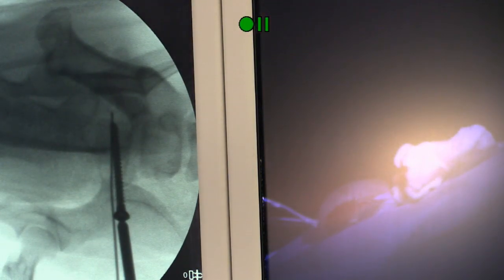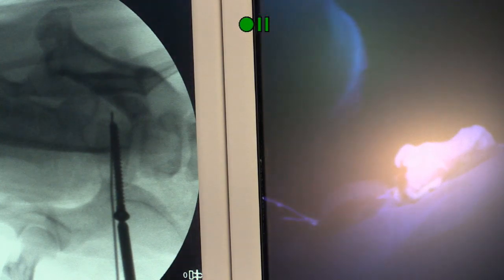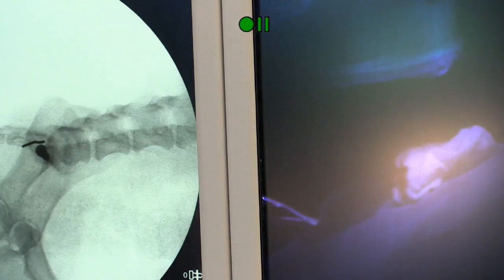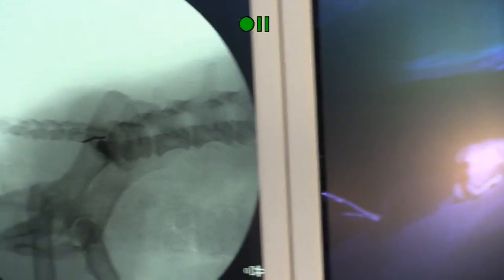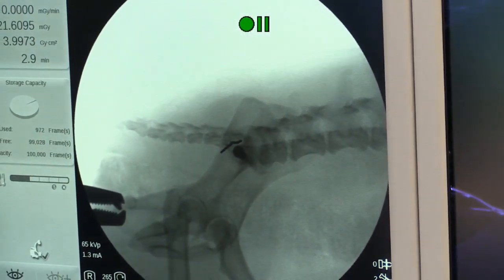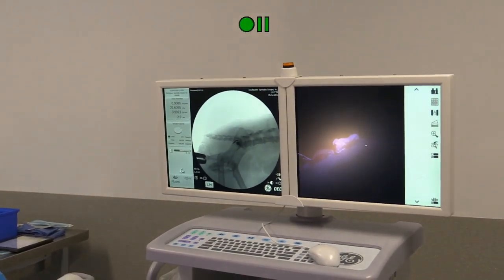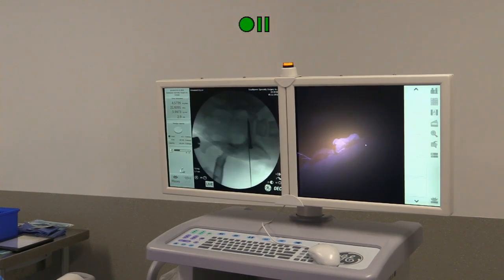So that's really solid there. You can see that screw is nice and robust. It's going to hold that really nicely. And James, are you going to pull that positional pin out? Yeah, I'll probably pull that out. I'm actually going to put a shorter screw in instead, so you get more compression? Yeah.